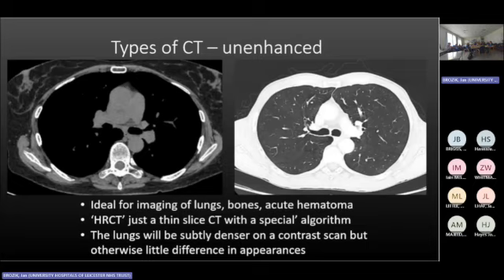I know there are studies with artificial contrast, some kind of AI technology. I have some reservations if we want to know if the blood is flowing in. We still need to inject. Yeah? But there are situations where, for a reason, you can't give contrast. The CT can still give you an answer you are not getting from chest X-ray.